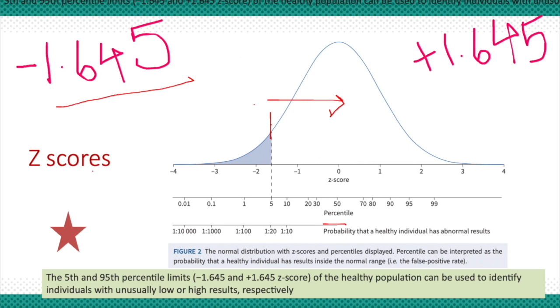So we would no longer be using the percentage predicted values to define normal and abnormal. We would no longer be using the percentage predicted FEV1 of 70% and above, or 60 to 40%, 40 to 35, and so on. We would no longer be dividing FEV1 and FVC ratios as mild, moderate, severe, and very severe, but from the 2021 guidelines, we would be determining the Z-score severity to ascertain if a patient has a normal score or an abnormal score.